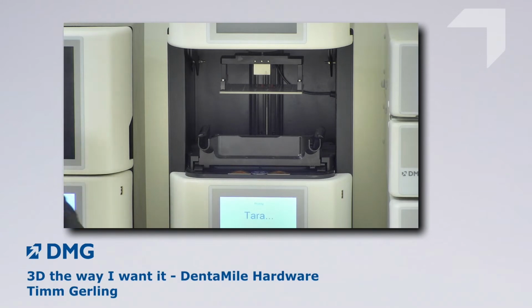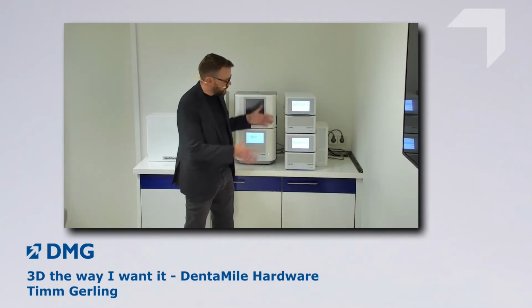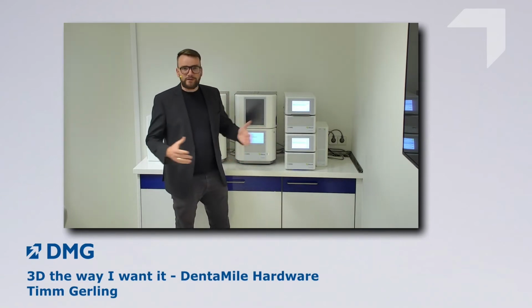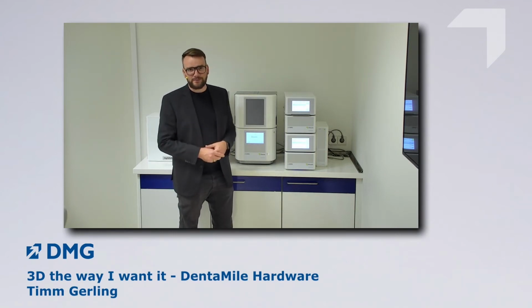This takes roundabout 30 minutes, and when the printing job is done, we forward it to the post-processing devices, the 3D Wash and the 3D Cure, and more details about all the devices, about the printers and our post-processing devices will be shown in detail in the next presentation that will be done by RapidShape, our technology partner, Mr. Andreas Schultheiss, who is giving you a nice overview about the devices. So thank you very much from my side, and bye-bye.